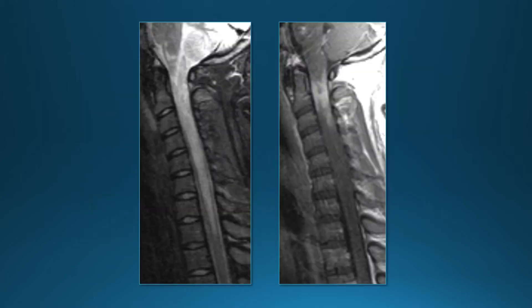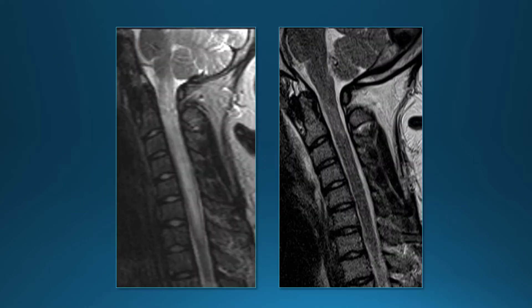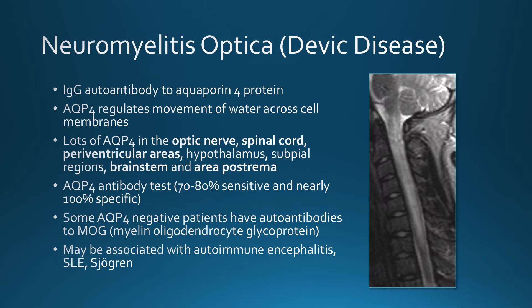This 30-year-old woman presented with weakness and paresthesias with fairly severe symptoms. There is a fairly extensive area of abnormal signal involving most of the spinal cord extending up to the medulla, with some patchy enhancement. The axial images show the lesion is quite extensive, involving both gray and white matter of the spinal cord. The image on the right is following steroid therapy.